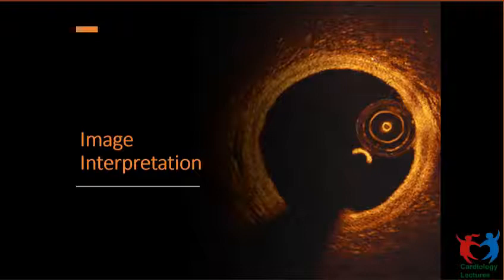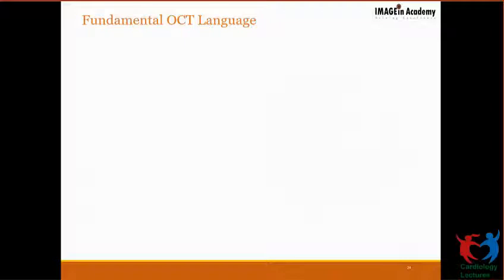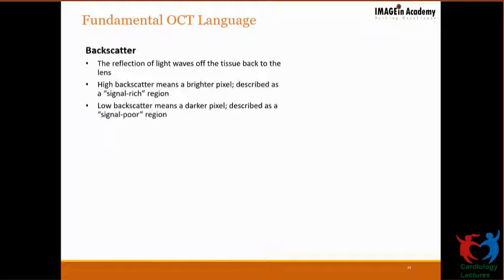All right. I think we move on to the next session, which is image interpretation, which is very, very important. There's a fundamental language which we use in OCT, which is dictated by the physics behind it. The first terminology we use is backscatter, which, if I have to put it in local language, is the reflection of the light waves.